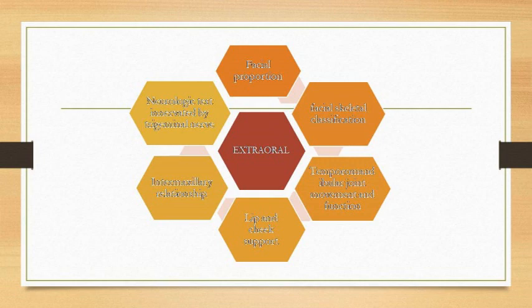Patients with removable prostheses should be evaluated with and without the existing restoration in place, so that a prosthesis flange for adequate support can be planned if deemed necessary. Facial skeletal classification. Intermaxillary relation, occlusal vertical dimension.